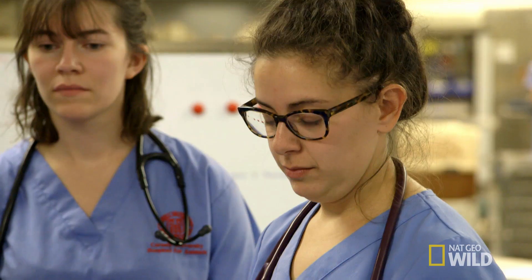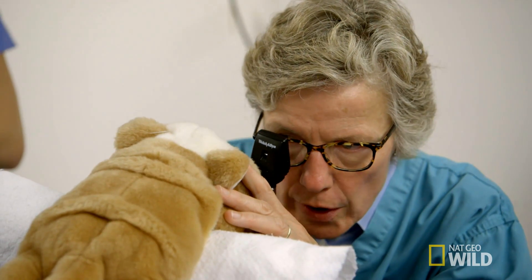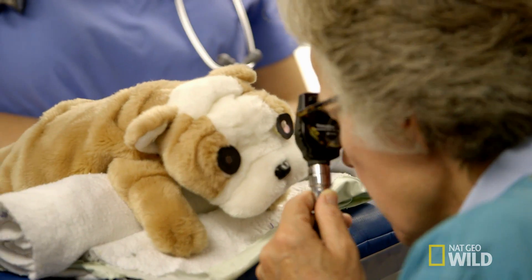To examine this dog's right eye, I'm going to hold the ophthalmoscope up to my right eye, and about here I'm at the right distance to do a good fundic exam with my instrument.